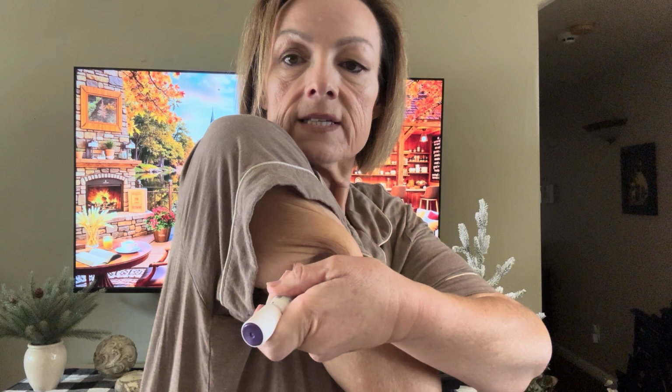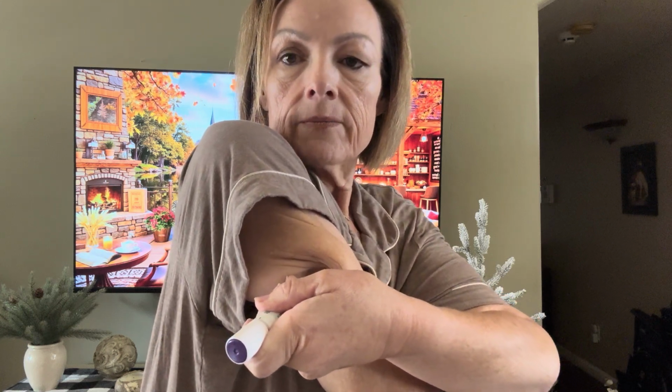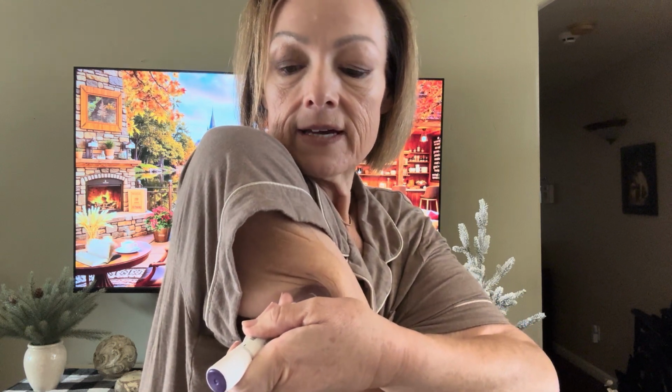back part. And we're pushing it in, and you push the button, and there's the second click. I didn't even feel anything this time. Wow. And I didn't even wait either. So we're just waiting to make sure that everything is in there. We're going to release. And right there, that's where it was.